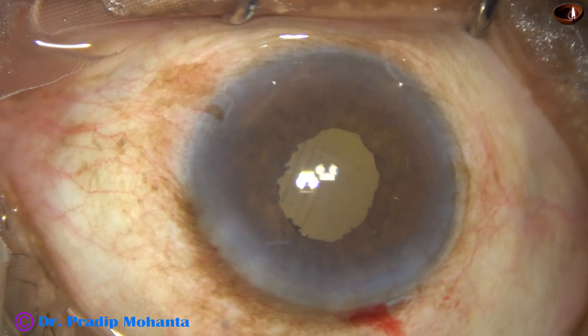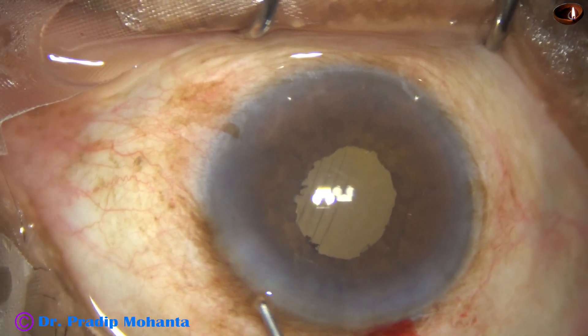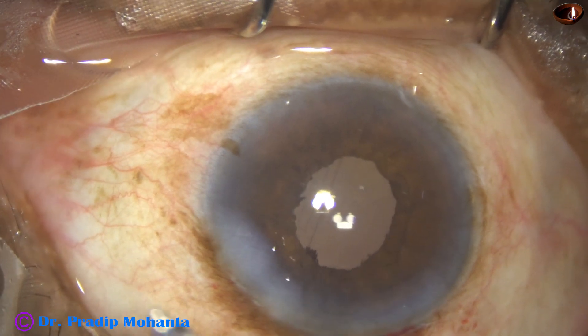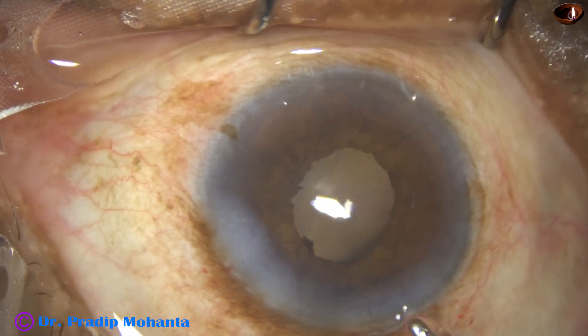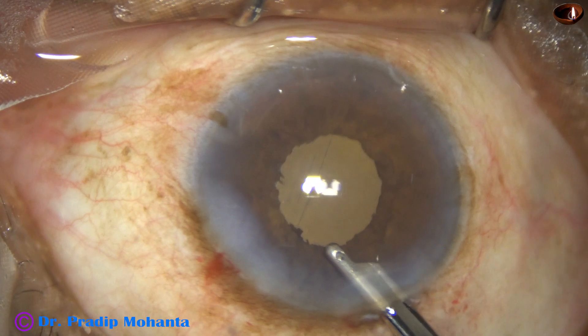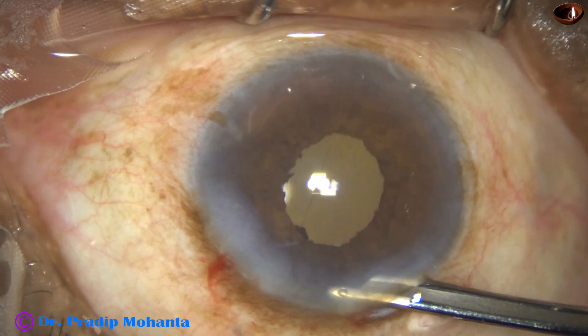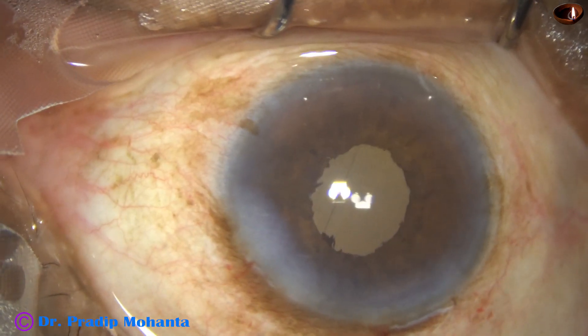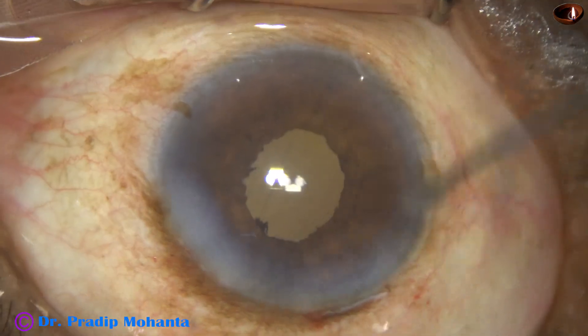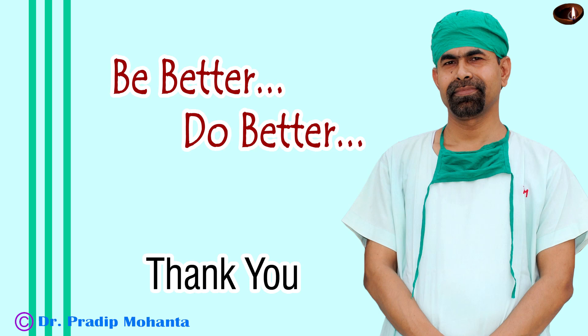This is some moxifloxacin. The only side port is closed by hydrating the corneal stroma on either side of the stab wound. We have managed this case with just one side port. If we had to use iris hooks, we would have needed four more stab wounds. Iris hooks lift the iris and the surgery becomes more complicated. So, we are done.